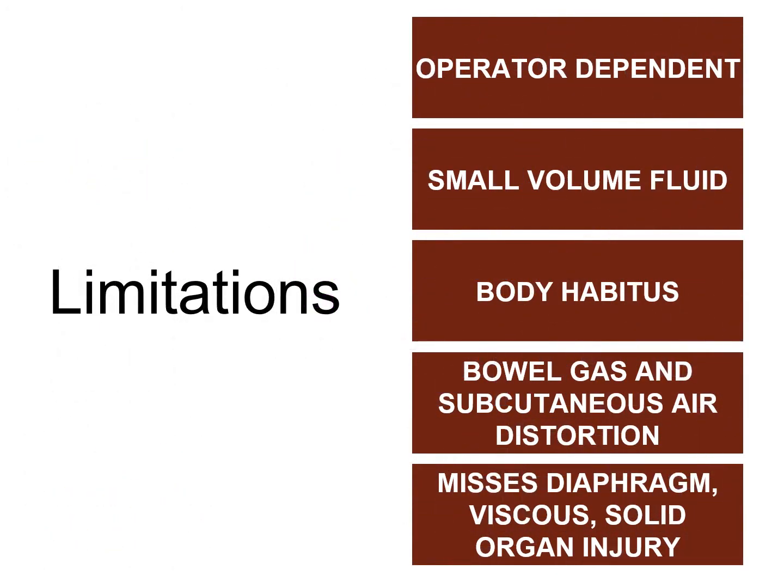So the FAST exam has limitations. Obviously, like any other ultrasound study, it is operator dependent. You need to be well trained, which you all will be. You also need to have done the scan, seen positives, seen negatives. You have to know what you're looking at. There is also, scientifically speaking, there must be some lower limit amount of fluid where the FAST wouldn't be able to see it, but the fluid is there, some small amount. Again, probably less than 100 cc's. Like any ultrasound study, it's limited by body habitus and bowel gas, and then with trauma patients, also air in the sub-Q will distort the views.